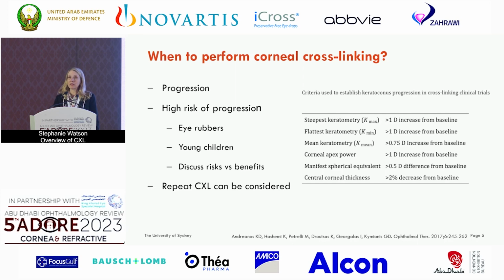But the steeper keratoconus is, the more variability you'll get in your Pentacam scans. When the cornea is very steep, even repeating the scan on the same day, you can see a 2 to 3 diopter variation, or even up to 3 to 4 in the readings for keratometry. And so it's good to have more than one measurement or one index that you're using to tell whether the patient's progressing.